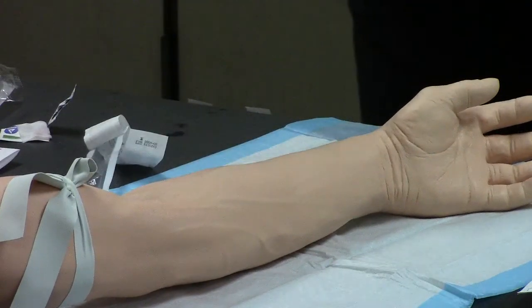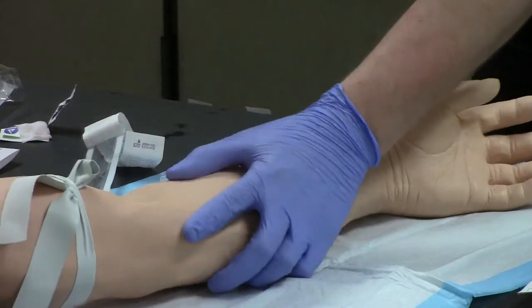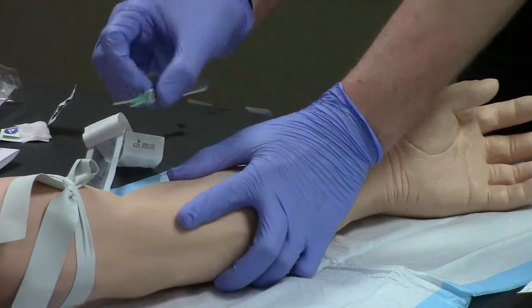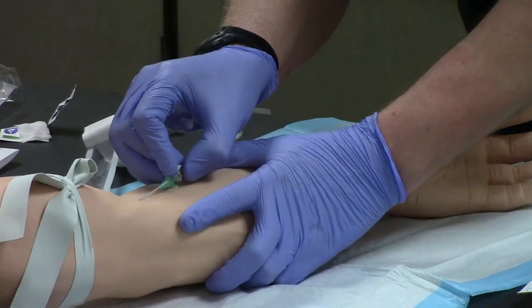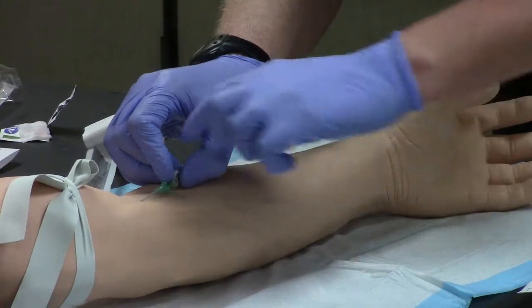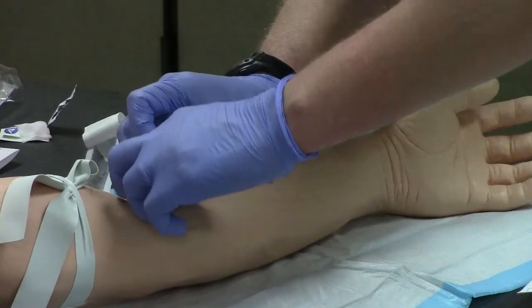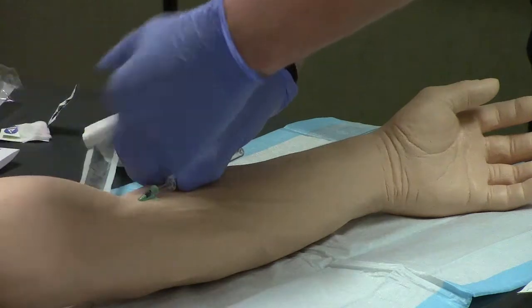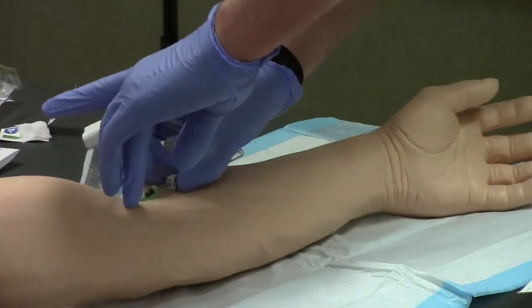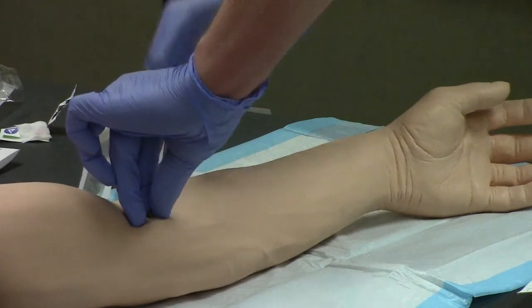I'm going to pull out my catheter and look at it, making sure I'm going bevel up. I'm going to hold it, pull down on the vein, and then at a 15 to 30 degree angle we're going to insert the catheter, looking for flash. I now have flash in my chamber, so I'm going to drop it down and advance it about an eighth of an inch, then advance the catheter forward. At this point, undo our tourniquet to release some of that pressure, then go ahead and occlude at the proximal end of the catheter, stabilize the hub, and pull the needle out.